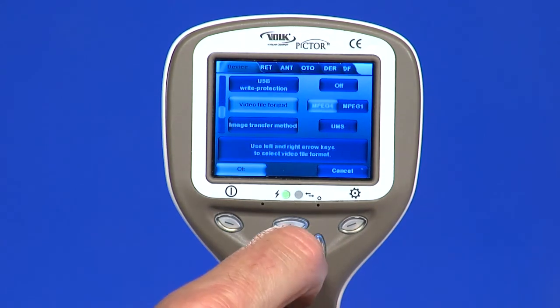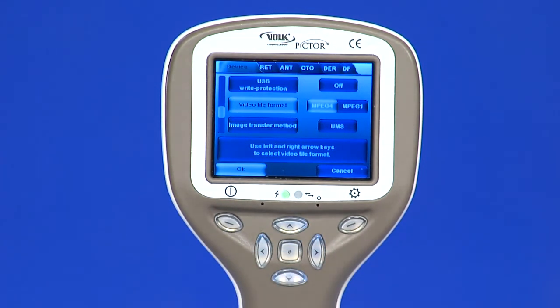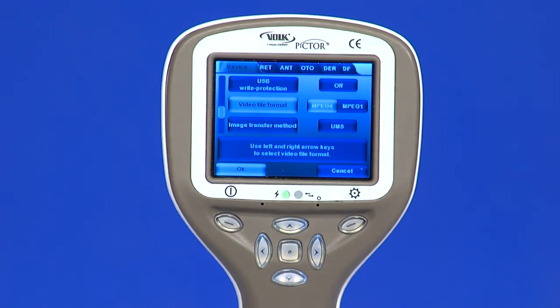Video file format: the camera has two file formats that the user can choose for videos — MPEG-4 and MPEG-1. MPEG-4 is a higher quality file format but may not be viewed with all video players. MPEG-1 format is more widely supported by different software applications.